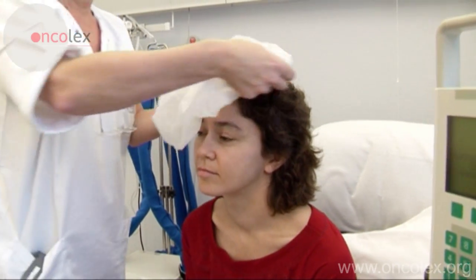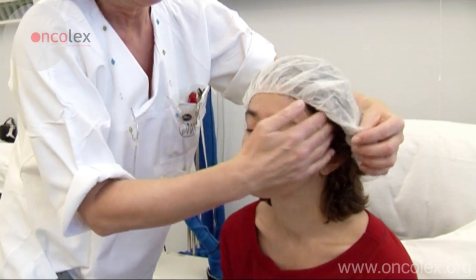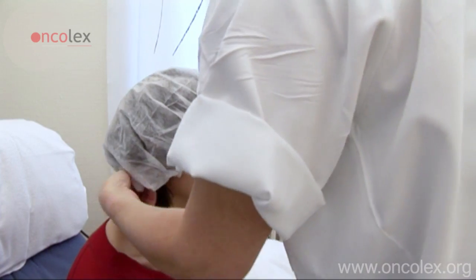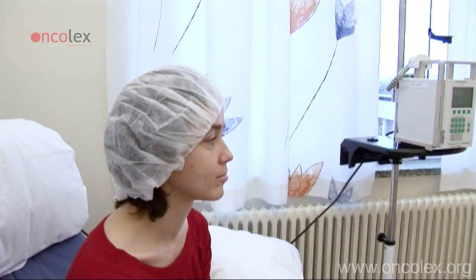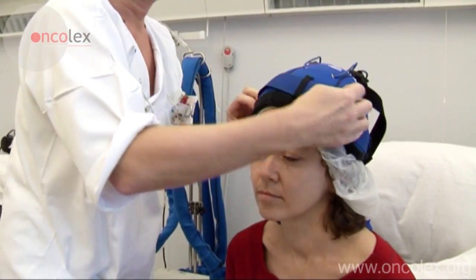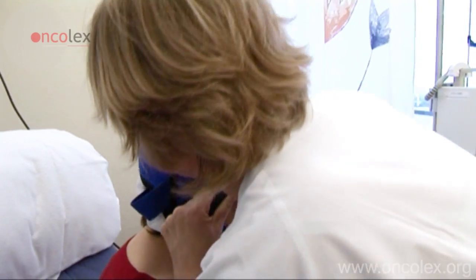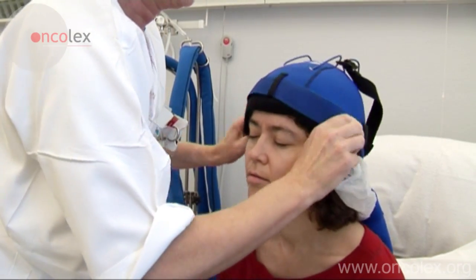To avoid condensation from the cooling cap freezing in the patient's hair, a paper hat is first placed on the patient's head. The cooling cap should be pulled well over the patient's head. It is important that the cap fits to the head as tightly as possible for maximal cooling effect.